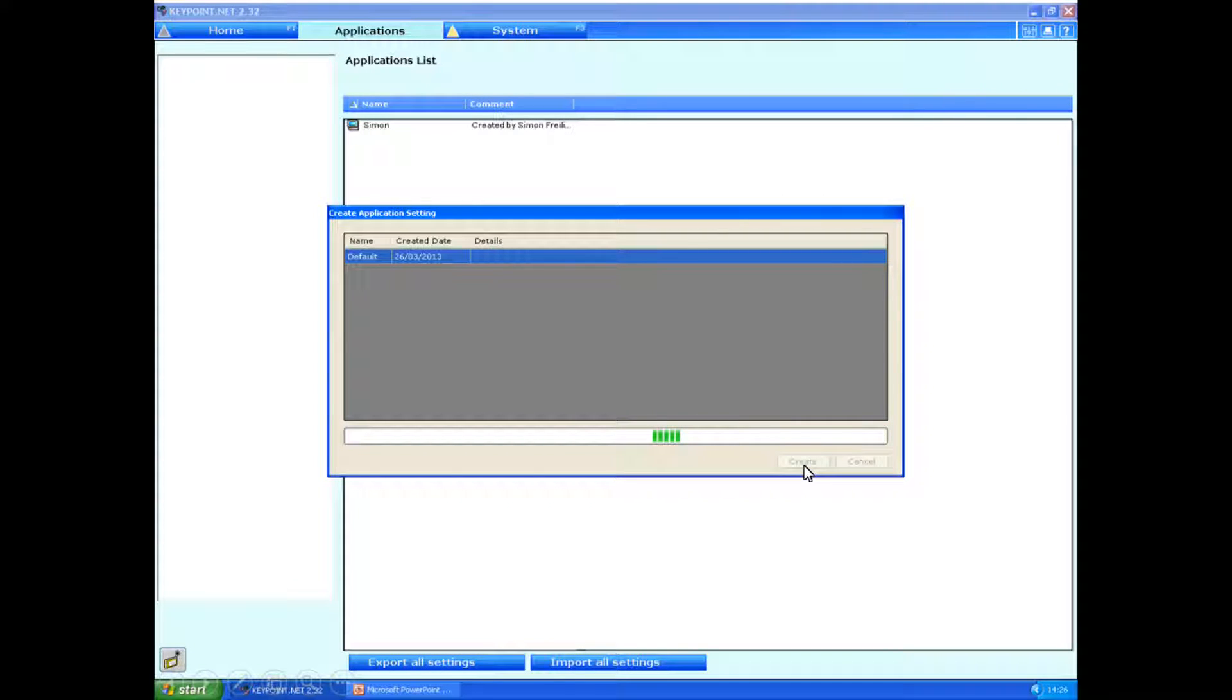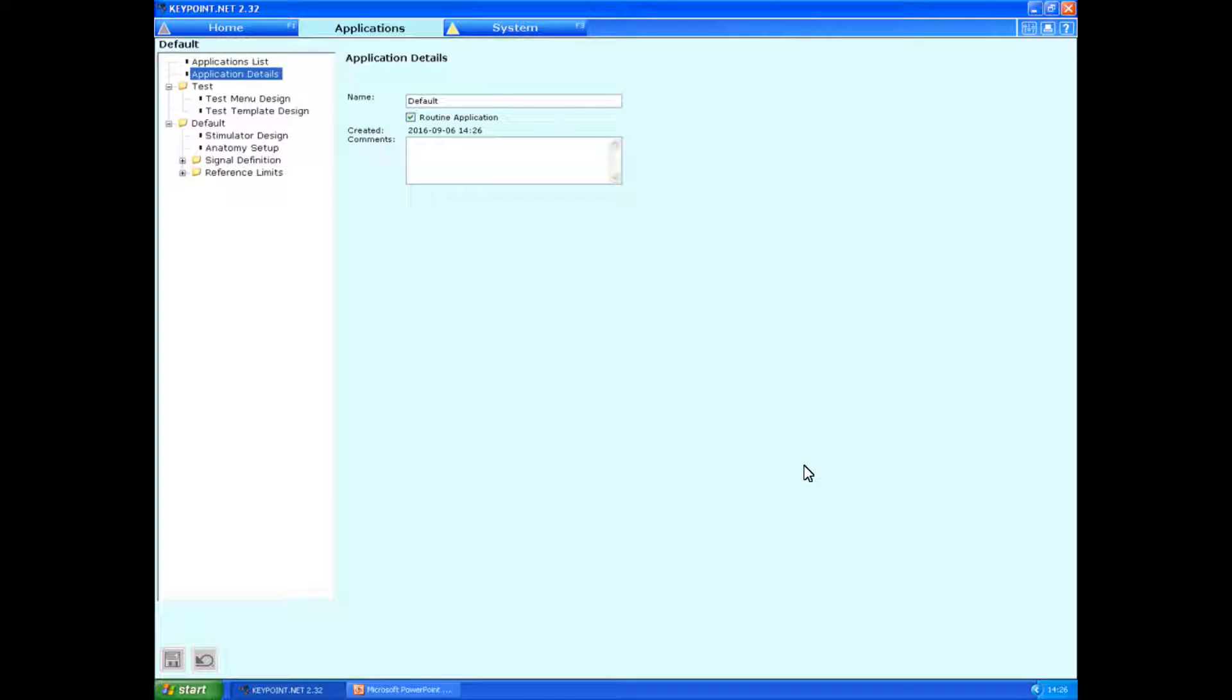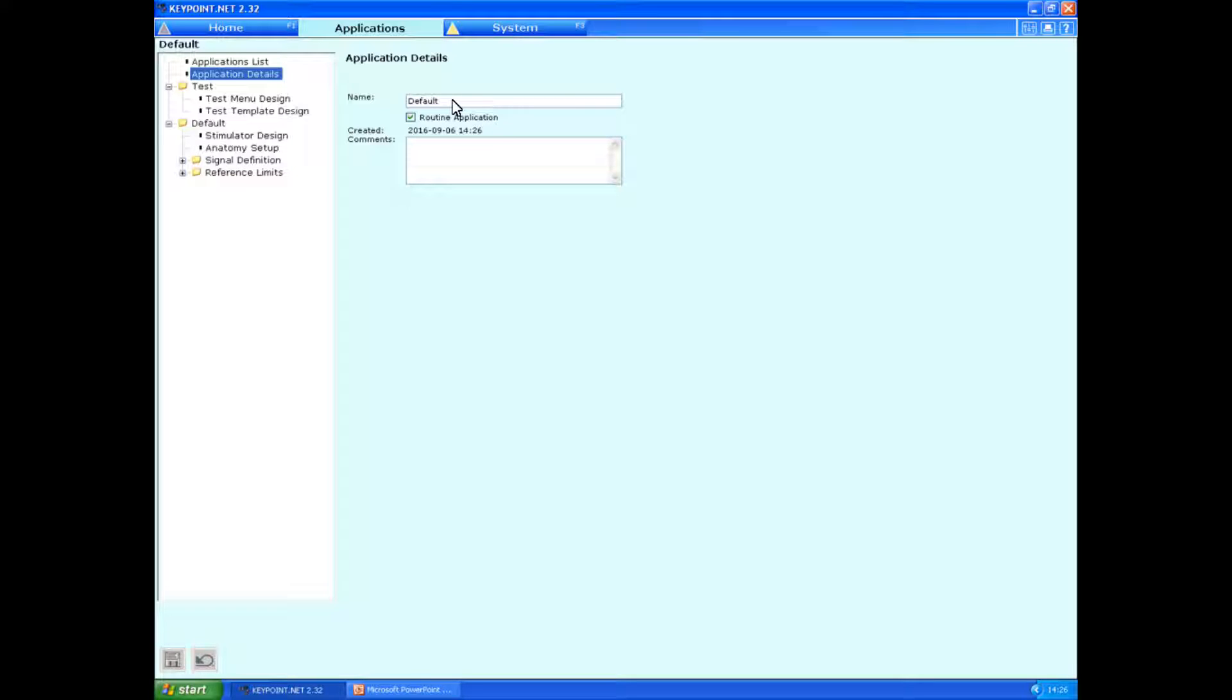Eventually you'll be brought to the application details screen. Here you can change the name from default to, for example, Simon or neurophysiology and make it more personalized. This is very helpful if a number of different people are using the same machine. Everyone can have it set up according to their own tastes.